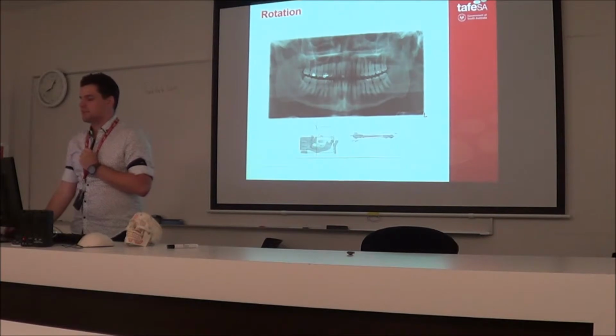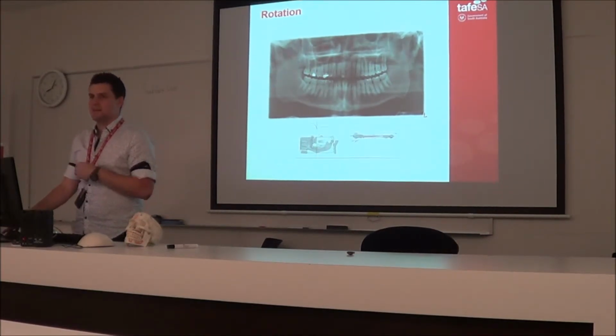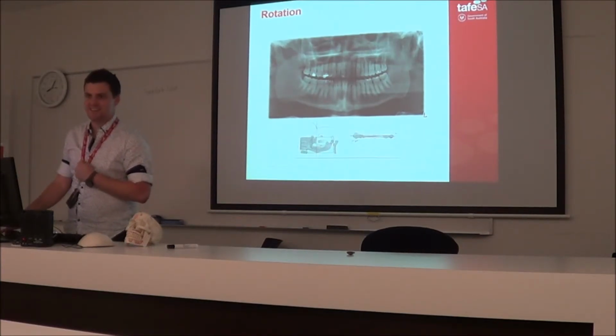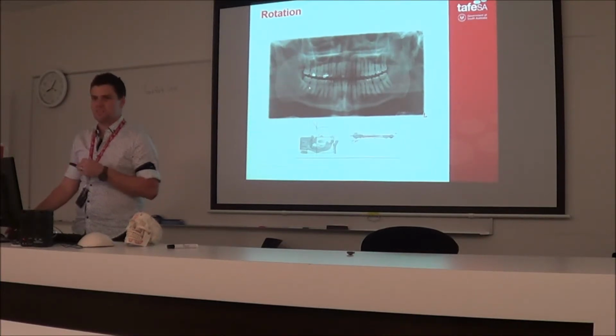So what I kind of remember is I always look at the skinnier side, and if it's the skinnier side on the left, it's the left to the left. The patient's left, that is, to the left. And vice versa, if it's too skinny on the other side, the right to the right. It's kind of the way I remember it.